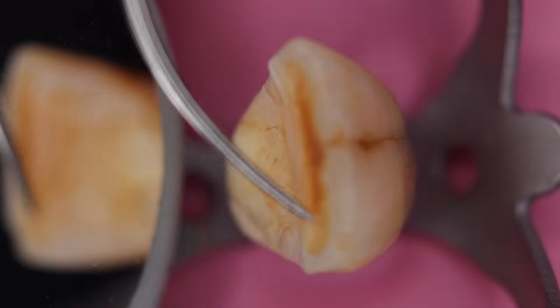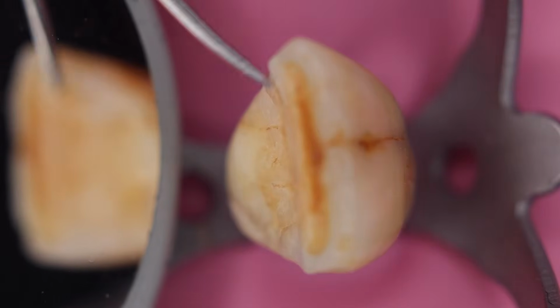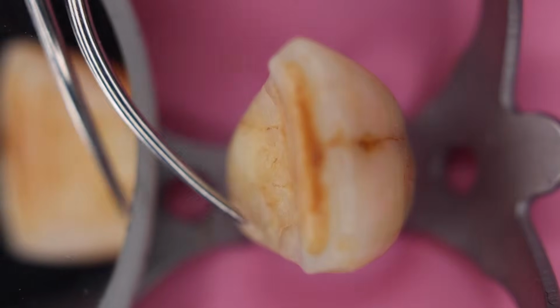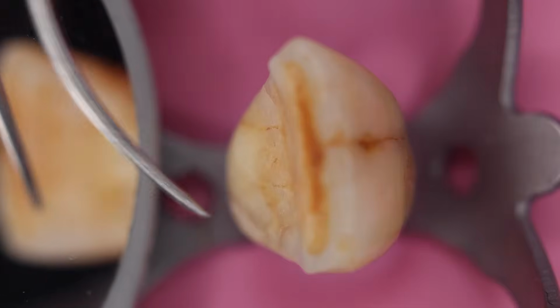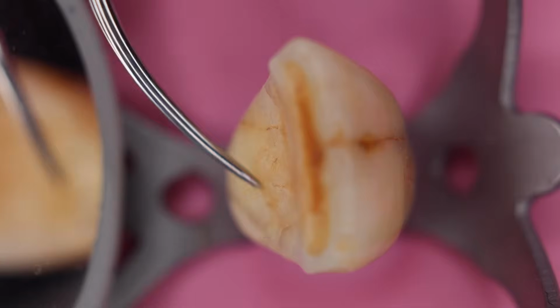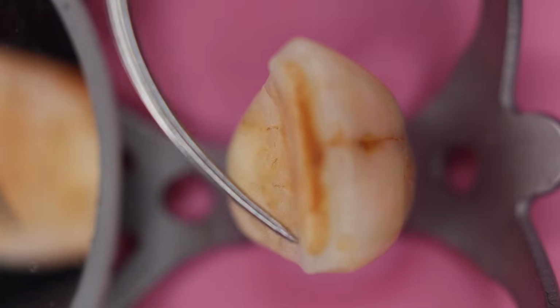Imagine this tooth and divide it into three aspects in the vertical segments: the distal aspect, the middle aspect, and the mesial aspect. Then in the horizontal segments, divide it into the cingulum aspect, the middle aspect, and the incisal aspect.